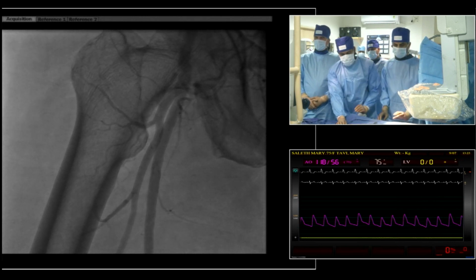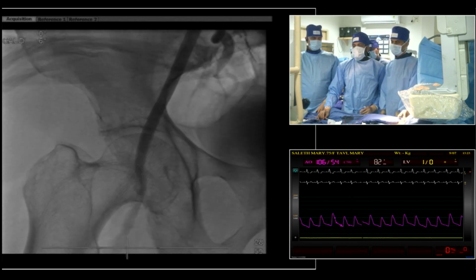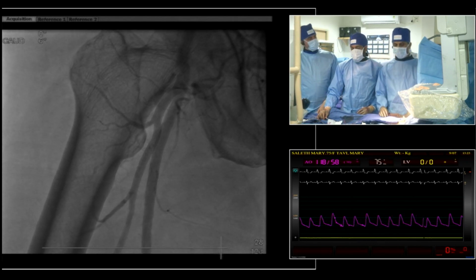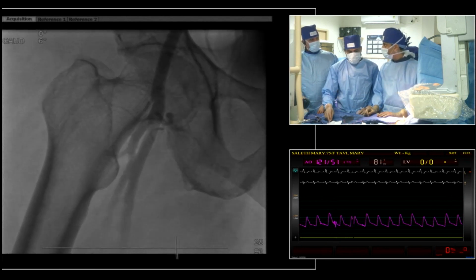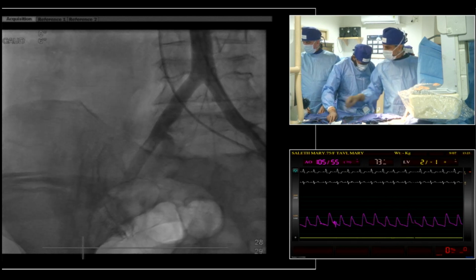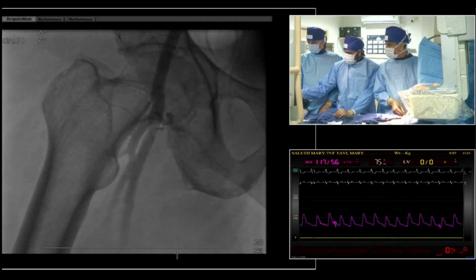Yeah. It looks very nice, hey? Yep, beautiful. Beautiful closure. There is no pinching of the vessel. Should we tie the second one, Sengo, or just leave it? I feel we should leave it. What do you feel? I agree. We don't want to cinch the vessel now with the second one. So this is a provisional technique. Blade, please. I think those are the provisional steps that you were talking about. I think it's very good.